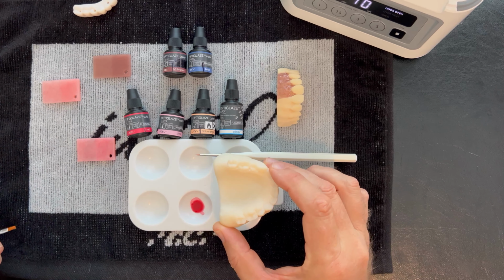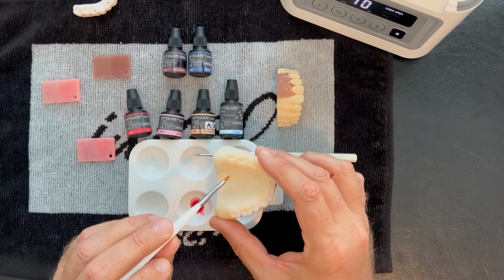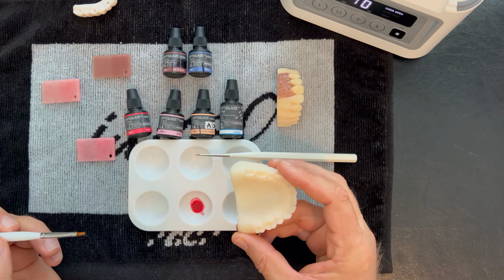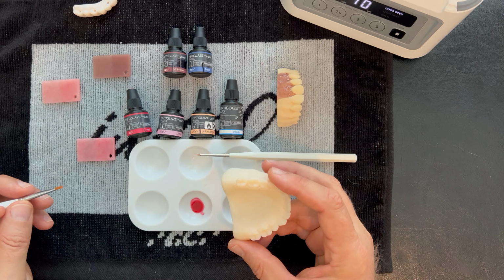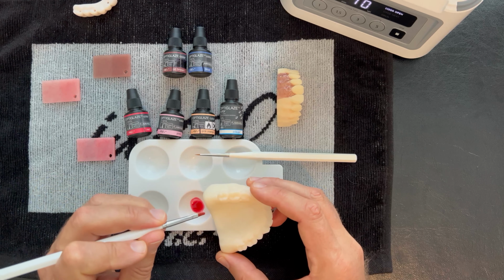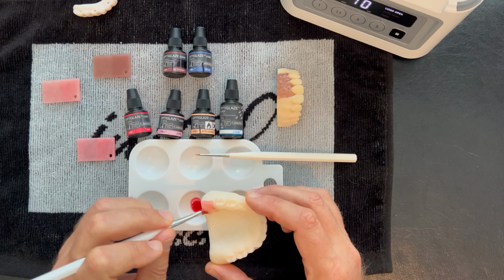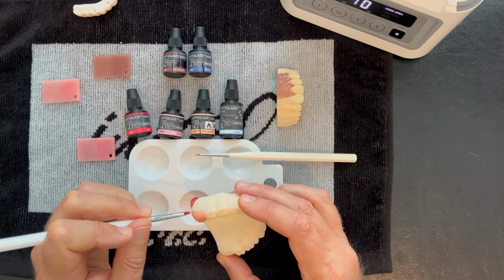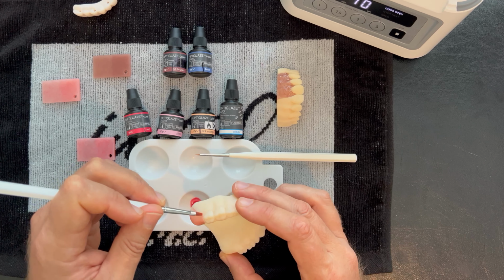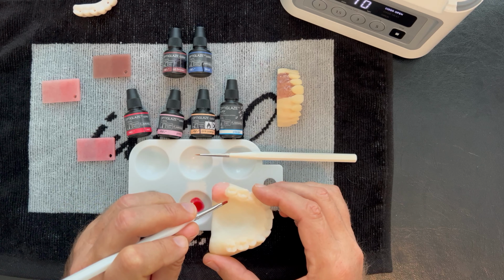So this has been sandblasted. It's what GC recommends for best adhesion and bond to print materials and MMA materials, would be to microblast with aluminum oxide. What brush you use is up to you. I'm going to do a broad open area here to help you see this and get this done faster. I typically use a brush this size to do these large open areas.